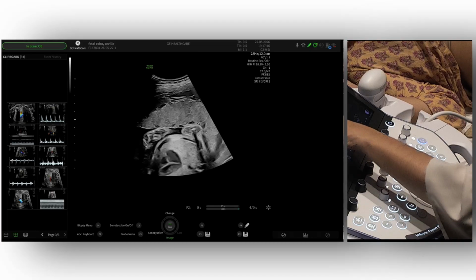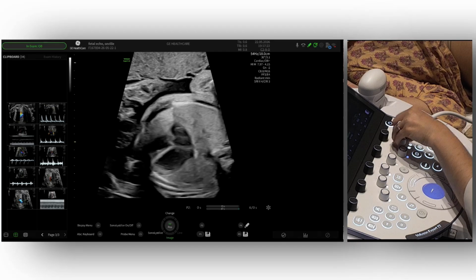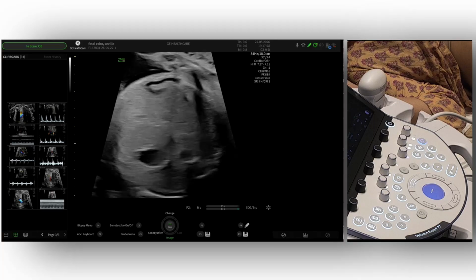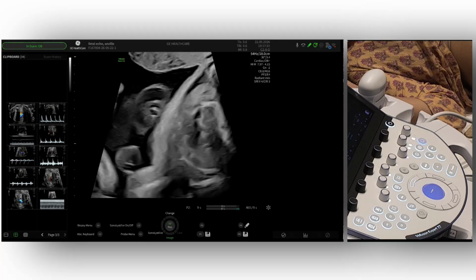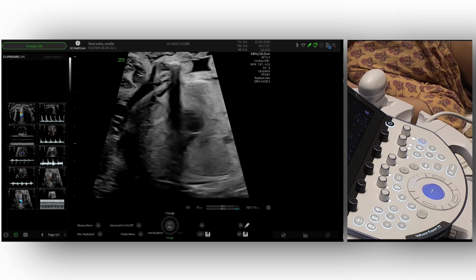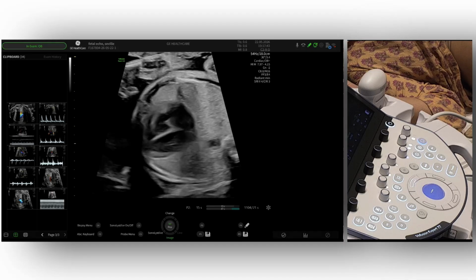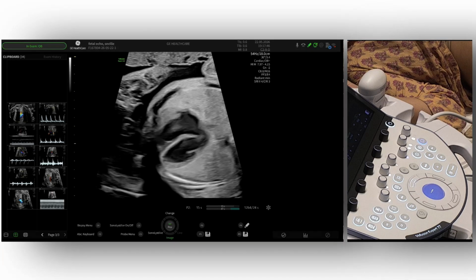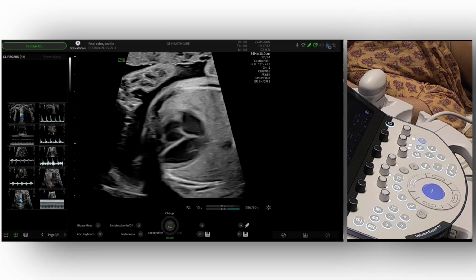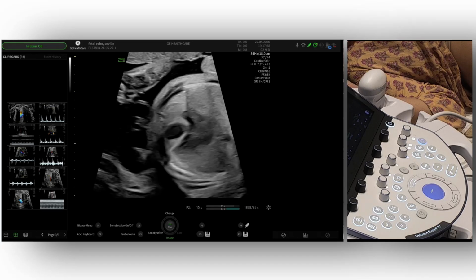And Fatima, when you first showed the Doppler of the umbilical artery to get, as you say, an expression of the ventricular rate, do you have a preference on sweep speed, or for any of the Doppler indices, pulmonary veins, pulmonary artery, in assessing rhythm disturbances? And if you do, could you show us? Regarding just the ventricular rhythm, or you mean the Doppler? Let's say the pulmonary artery, pulmonary vein. If we go to Dopplering in that region, let's look at our sweep speed.